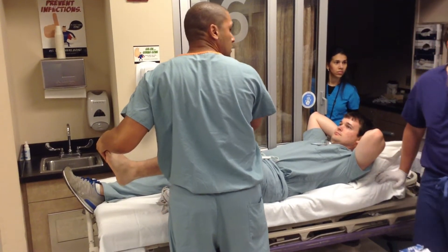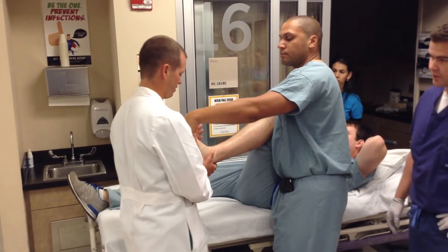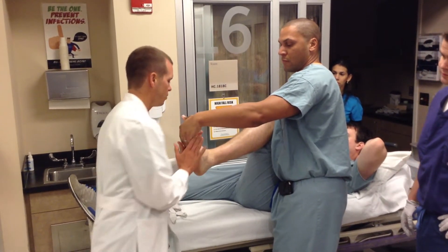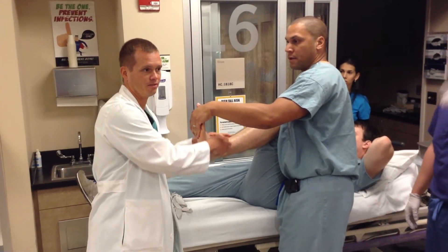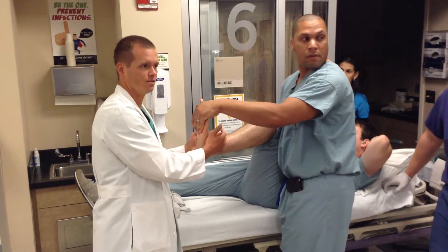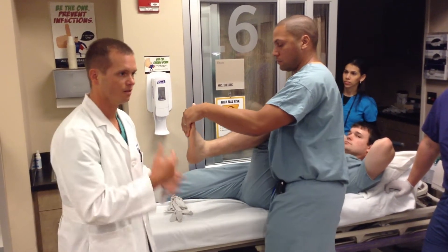That 90 degrees is really important, because if you hold their foot plantar flexed and then when I take it from you at the end and put that foot in my chest, you push all that soft roll up and it bunches up right in the front of their ankle. When you take that down, they've got a big pressure sore right in front of their ankle because it causes a bunch. So you want to be putting that soft roll on in the same position that you'll have the patient in.